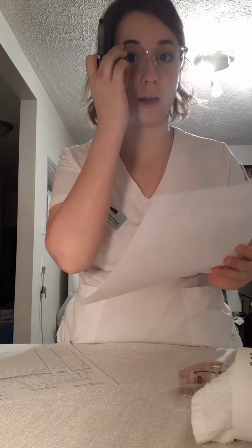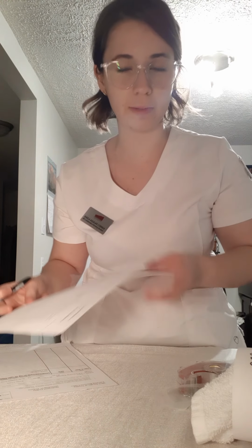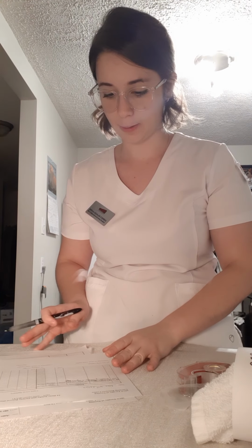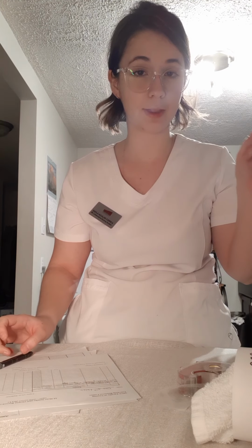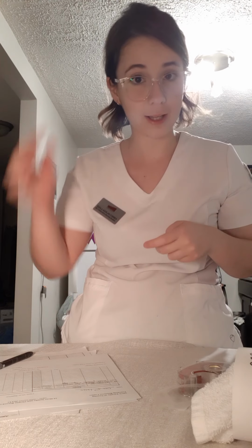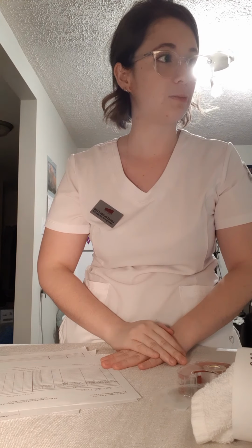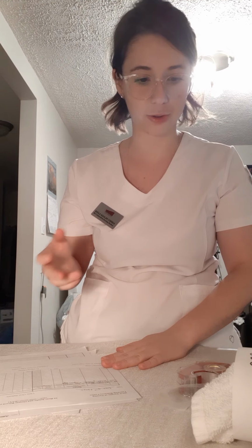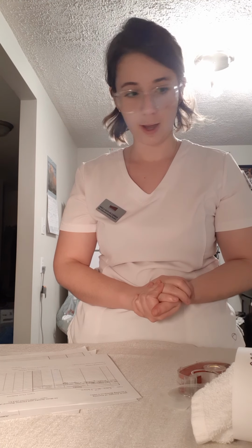So in 20 minutes, I'm going to check my patient, and I'm going to make sure that the medication has run through, and I will write down there how much went in, which should be 50 milliliters or 51 milliliters. And I would also go back and adjust the primary line rate to the initial rate, whatever was set up, just to make sure that it's not going too fast or too slow for my patient. And yeah, so I did my documentation and I educated my patient. So I believe I am finished.